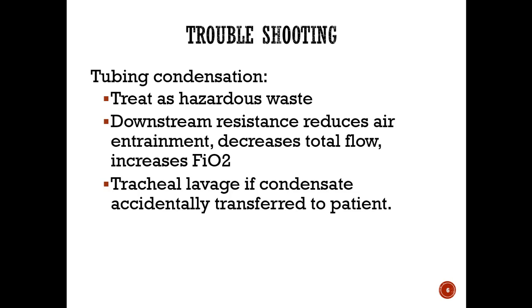And we'll see this in lab. We'll do some examples where you guys will analyze, and we'll actually fill the tubing with water, and you guys will see that FiO2 climb. But that's something that we also need to be aware of. So those are the troubleshooting points, and really tubing condensation, I feel like, is a big part of that.